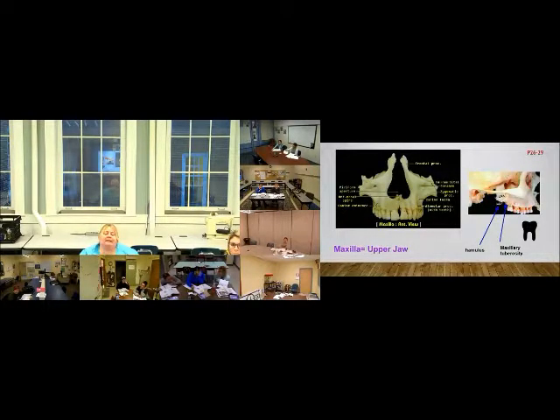So let's look at the maxilla in a little bit more detail. So remember, the maxilla is the upper jaw. And so the maxilla being the upper jaw, we call the teeth on the upper maxillary because they are in the upper jaw. And there are two landmarks that are most important for us to know because they will be on the RHS. And those two landmarks on the maxilla are the hamulus and the maxillary tuberosity. As we start to learn more about our anatomy of x-rays, I'm going to point those out to you a million times.